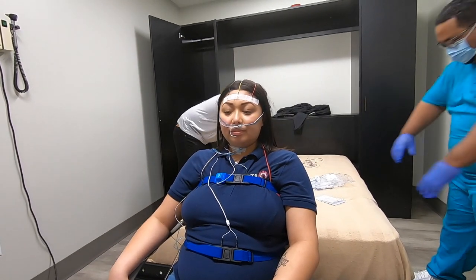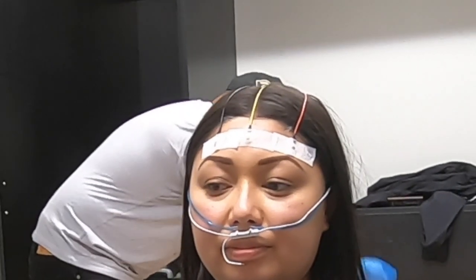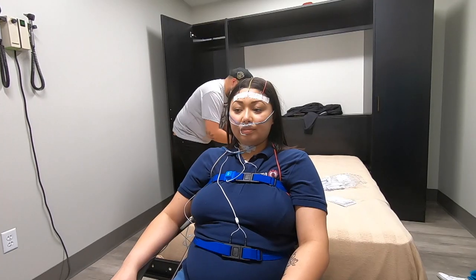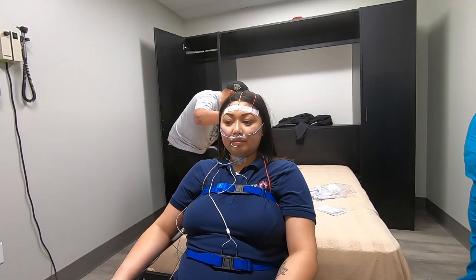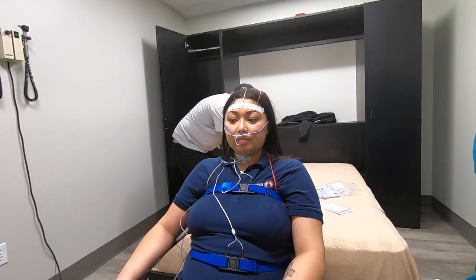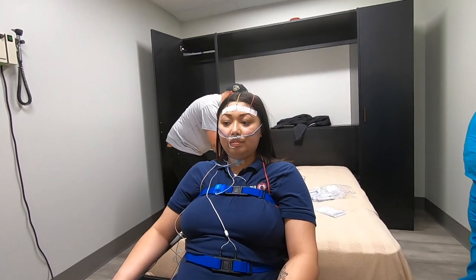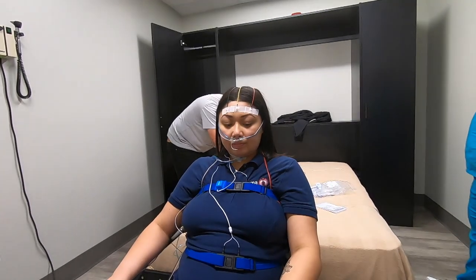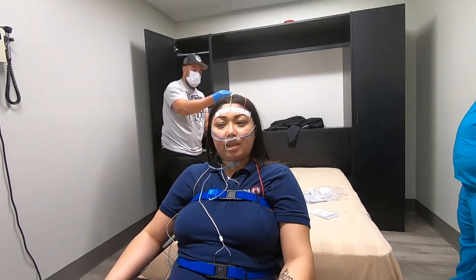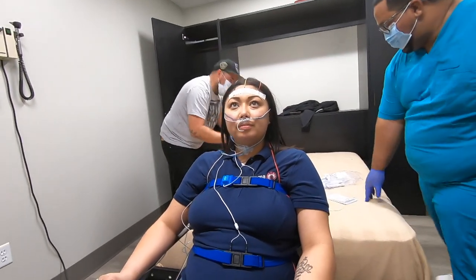The electrodes that Ray just put on to the side of the head — the ones on the forehead — are called your F channels. Frontal: the one on the left is F3, the one on the right is F4. On the left side they always have an odd number; on the right side they have an even number. Those are actually EEG channels, so we can get brain activity out of them. The brain activity in the frontal channels is used for high amplitude — that's where delta, or slow wave sleep, is seen.